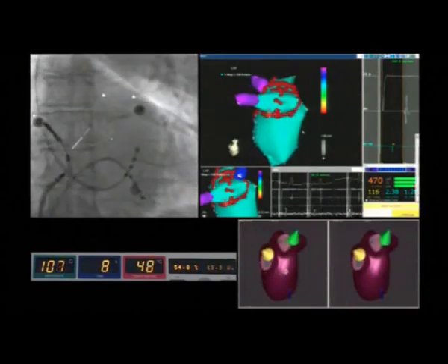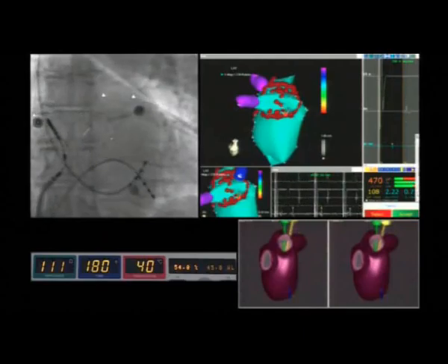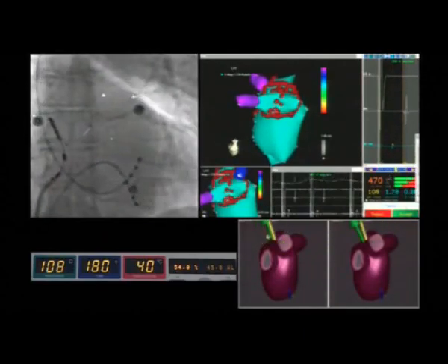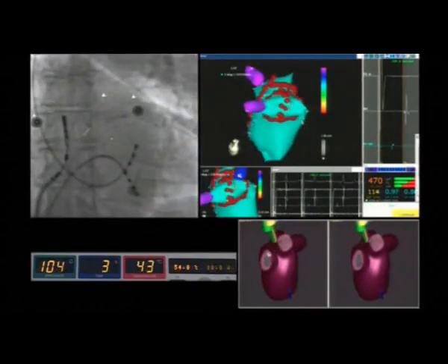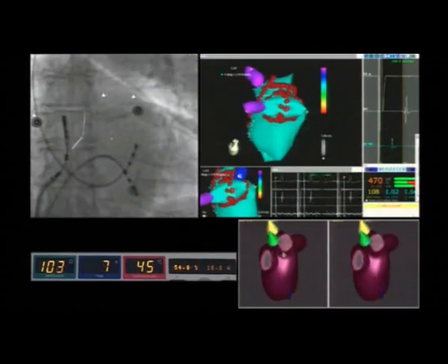The radiofrequency applications are of short duration and are associated with the complete abatement of atrial electrograms. The lesions are linear and continuous due to the catheter stability, as shown on the fluoroscopic image on the top left panel.